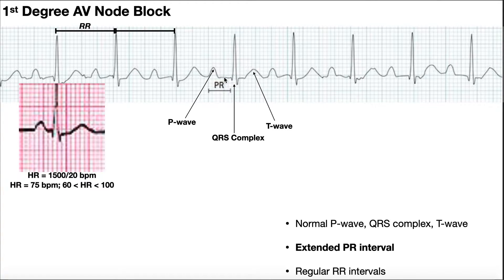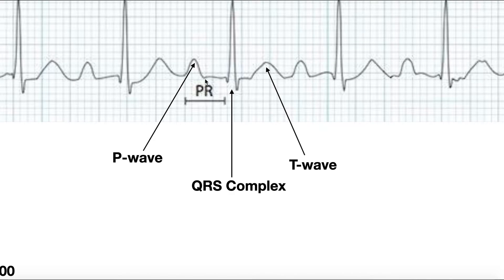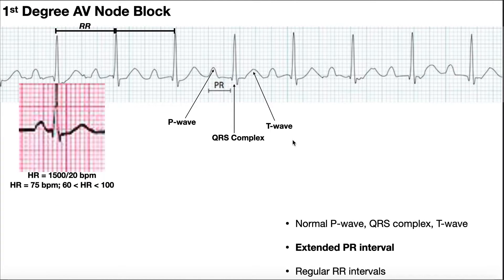I don't really like counting boxes. One thing you should get good at is eyeballing the horizontal line between the end of the P wave and the start of the QRS. If you look at enough of these, you can tell if that line is elongated. This one is really short, so I know it's not elongated without even measuring. But this distance between the end of the P wave and the start of the QRS looks pretty elongated — so even without measuring, I could say it's probably an AV node block.